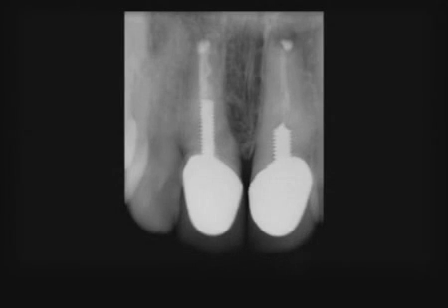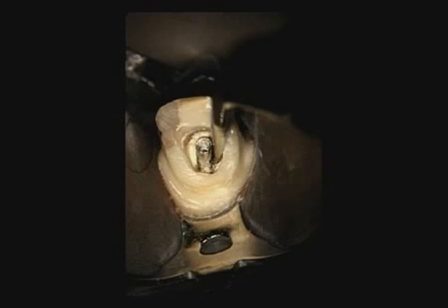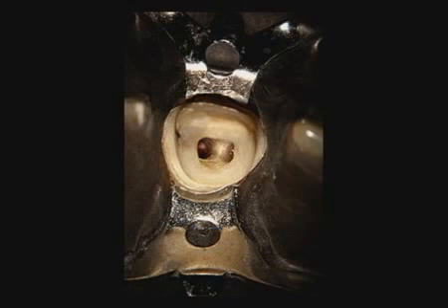This preoperative film of the central incisors reveals crowns, posts, inadequate endodontics, a mesiocrestal perforation, and osseous pathology. The crowns were removed and ultrasonic techniques eliminated the post. A photograph following disassembly procedures reveals the true canal and a mesiocrestal perforation. Through this defect, you can see the granulation tissue.